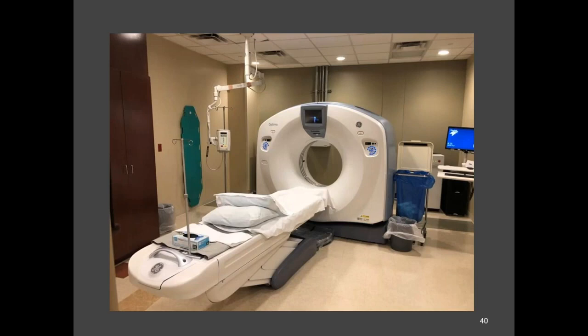Okay, so IRCT. I didn't know until recently, when I started working on CTMR, that there was such a thing. I've always been in the lab, so I've never seen them do a procedure in CT, but now one of the systems I take care of is a dedicated IRCT system. That piqued my curiosity: what exactly do they do with a CT scanner in IR? Yes, it looks just like every other kind of CT scanner.